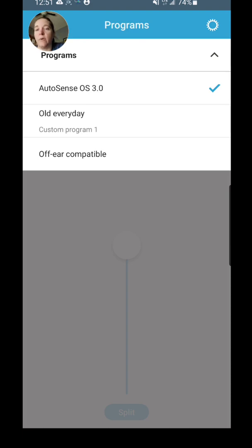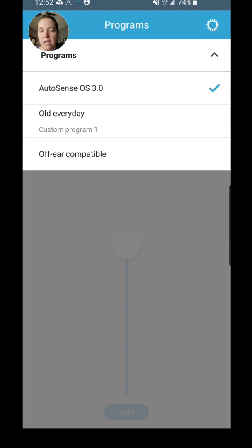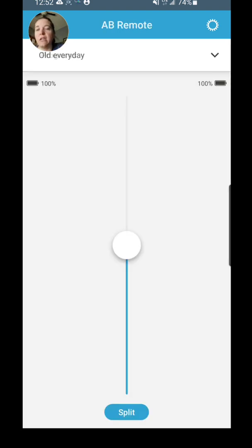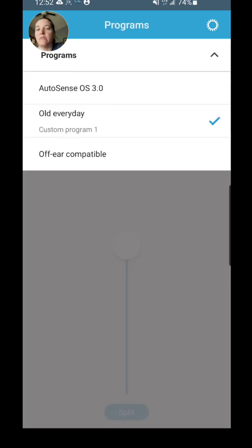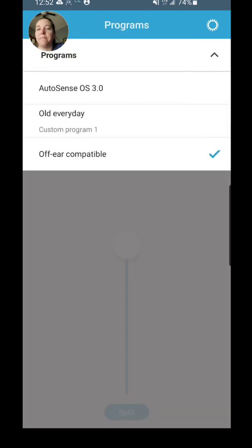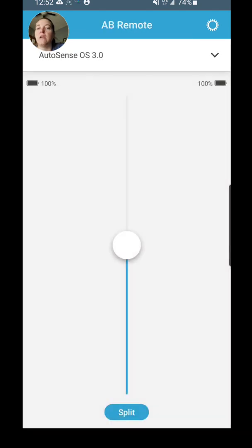This shows you the programs that are available right now. So I have my AutoSense OS 3.0, I have my old everyday program that we had loaded just because I wanted to be able to have my kind of backup in case I didn't like the AutoSense OS, and then I also have my off-ear compatible program. I can check and change to any of those just by tapping on them.